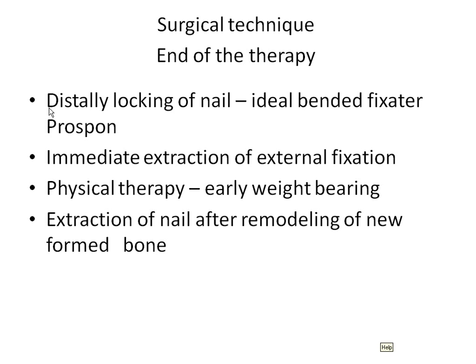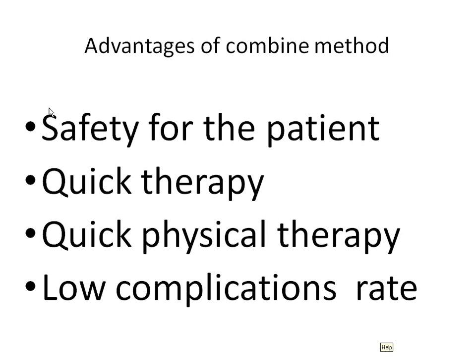For this locking, the ideal option is the banded fixator Prospon of Czech production. It allows us to lock without removing the external fixation, and then of course we extract the fixation when we lock the nail. Physical therapy starts immediately, and extraction of the nail we allow minimally 1 year after. So the advantage is safety for the patient, quick physical therapy, and a low complication rate.